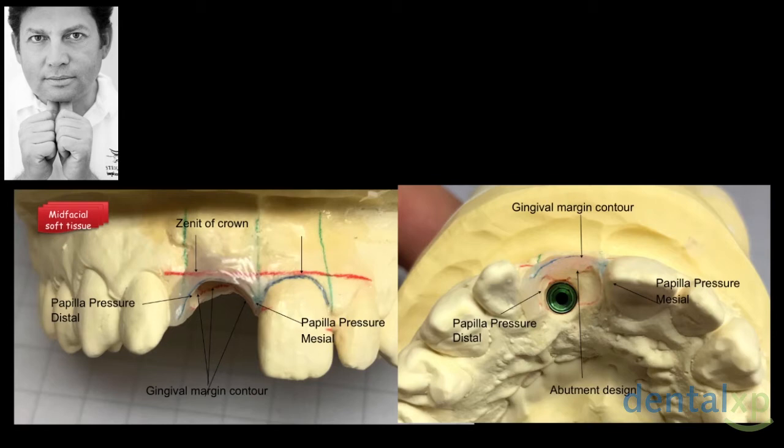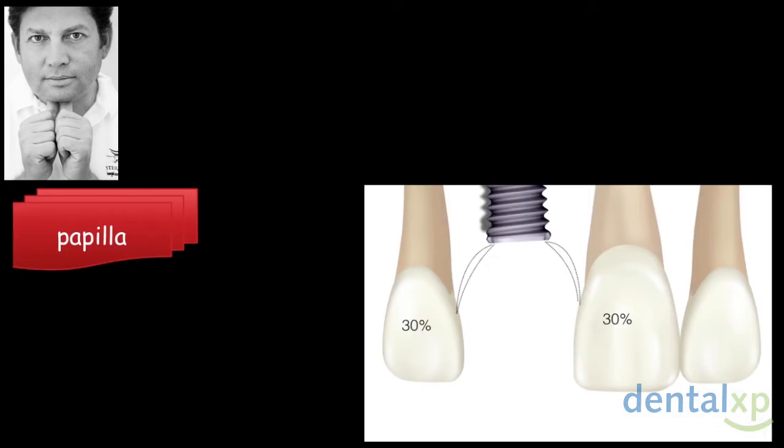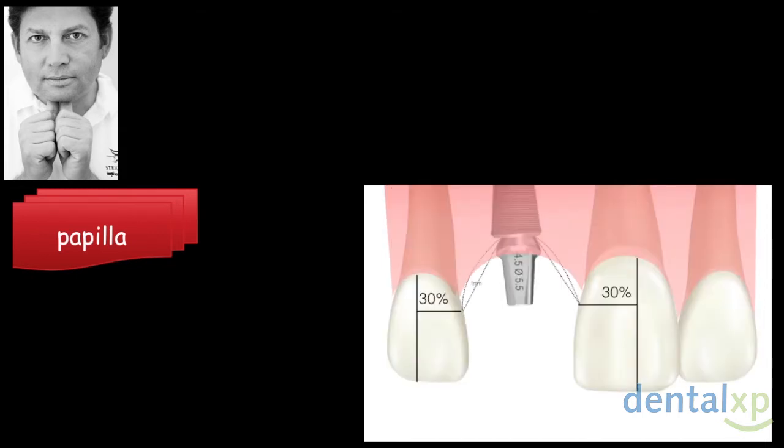When we go from single to multiple, it's different. So we have subtraction and additive methods for creating this kind of design. And today that's the way we do it. We can do all that and then develop this design. So see, I'm positioning my contact points according to Chu's paper. We don't use that 5mm rule. And then we connect the abutment emergence point with the contact points of the future crown.